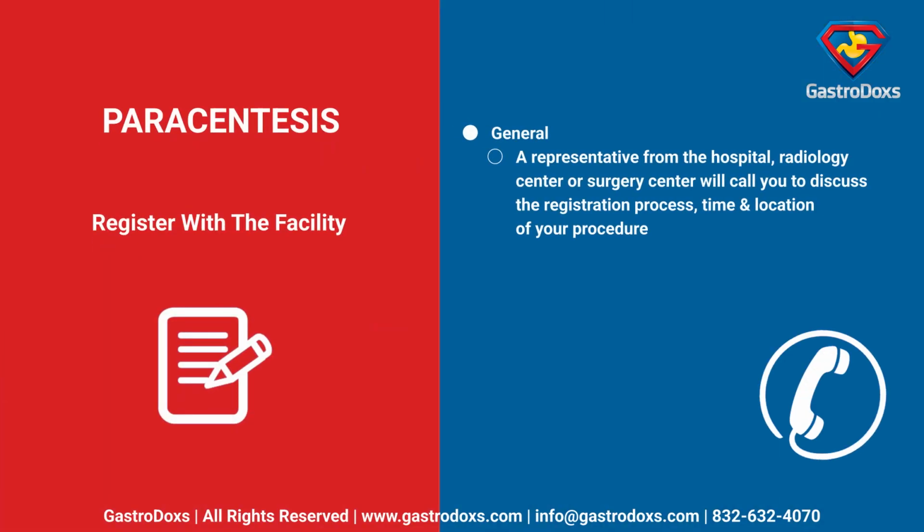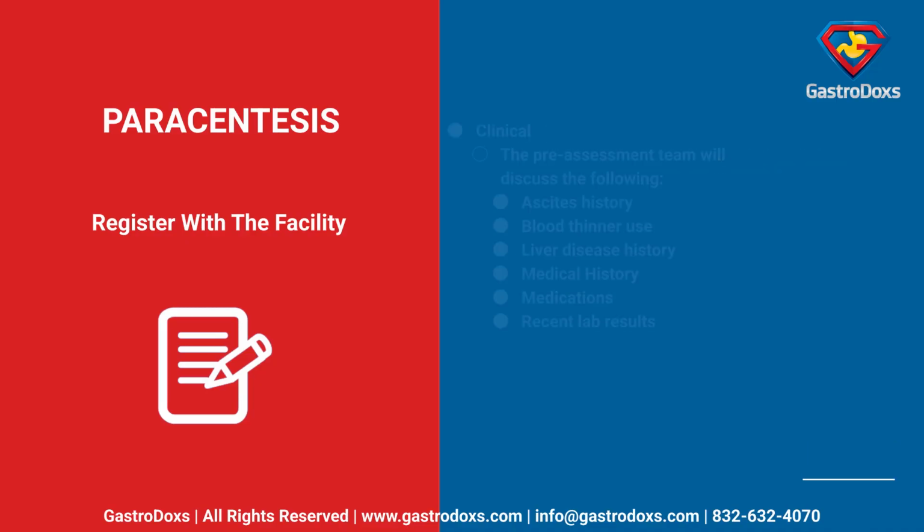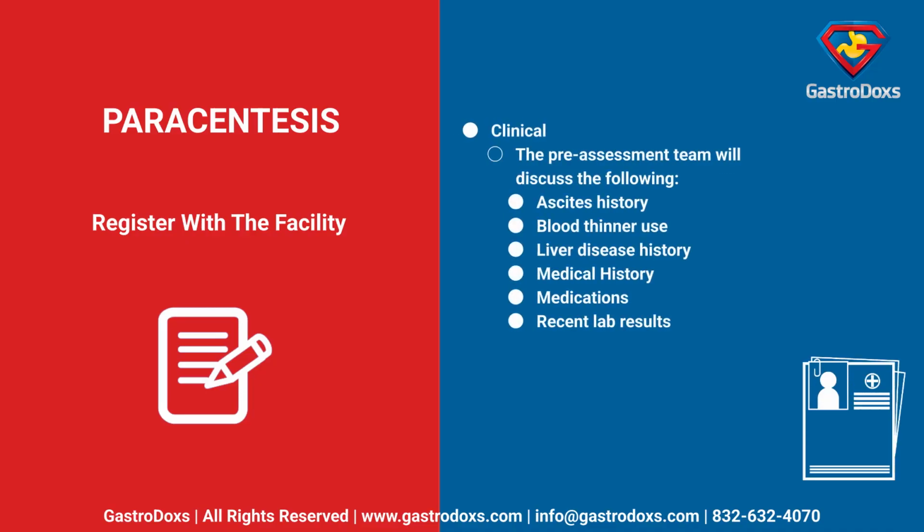General. A representative from the hospital, radiology center, or surgery center will call you to discuss the registration process, time, and location of your procedure. Clinical. The pre-assessment team will discuss the following: ascites history, blood thinner use, liver disease history, medical history, medications, recent lab results.